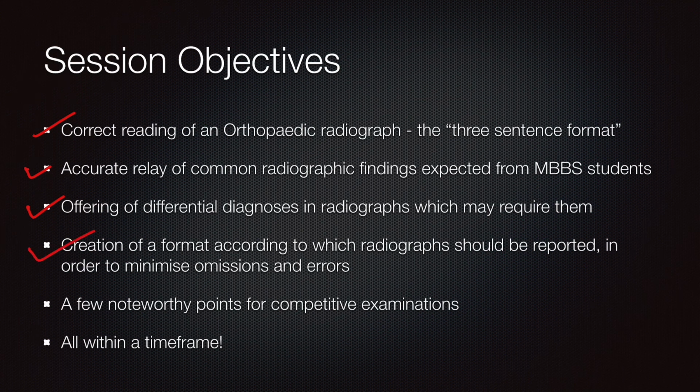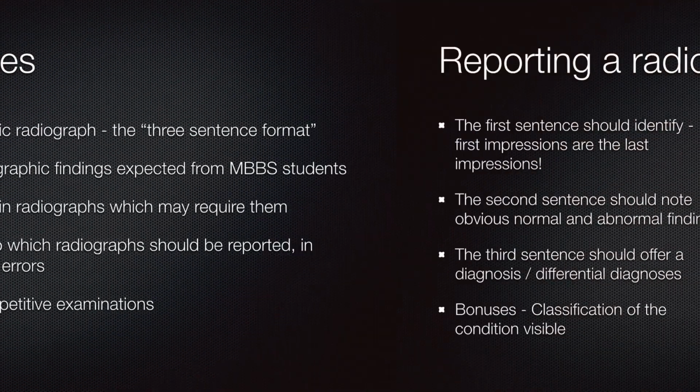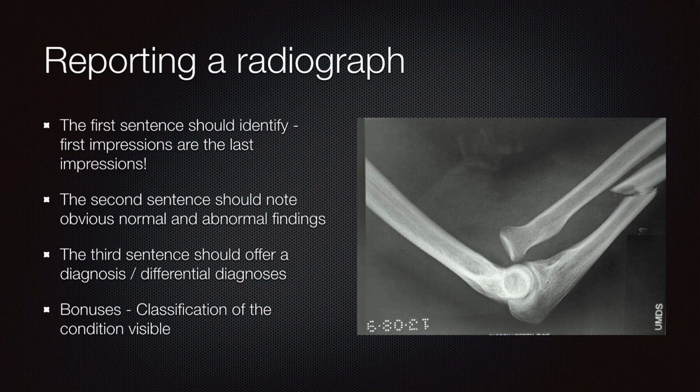So this is a format which we will create in which you should report radiographs in the exam as well as in clinical practice in order to minimize omissions and errors. I will also try to cover a few noteworthy points for competitive examinations in the upcoming sessions, and all of this of course within a time frame given your limited time that can be given to this kind of a topic. So reporting a radiograph runs on a few basic principles, and the few basic principles are as below.